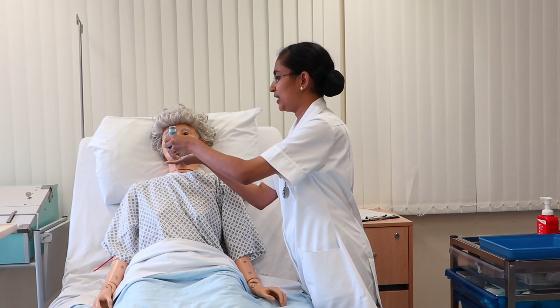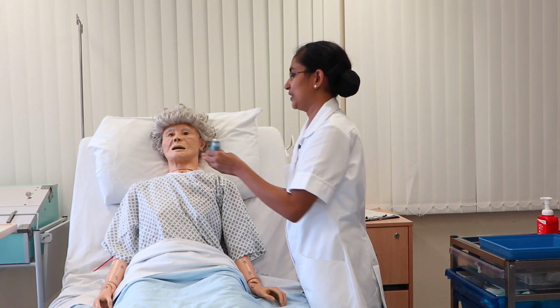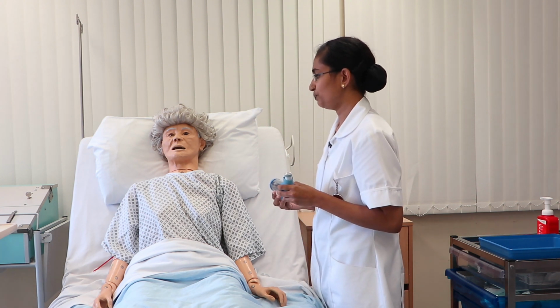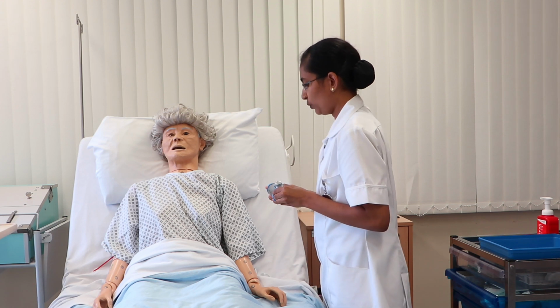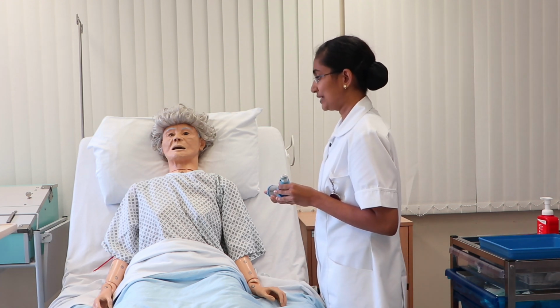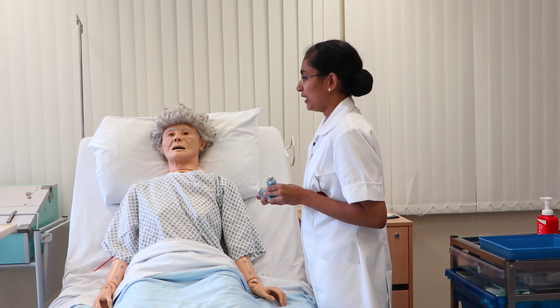Inhale, exhale. 1, 2, 3, 4, 5. Okay, I am going to remove it. You can have a pursed lip exhalation. Are you all right now? Okay, so we are done with the procedure, and don't worry, I am here to monitor you for 30 to 60 minutes. So if you have any kind of side effect, you can let me know.